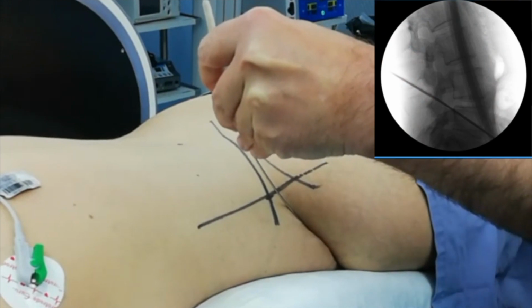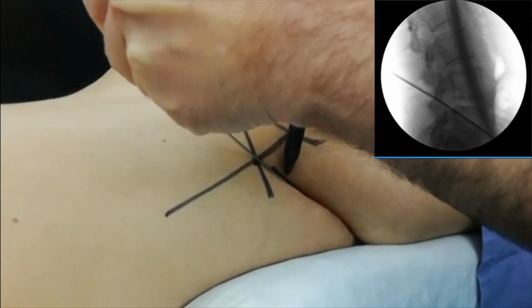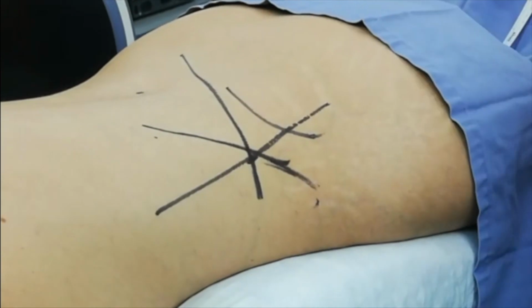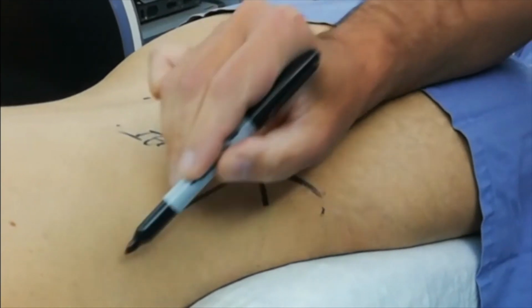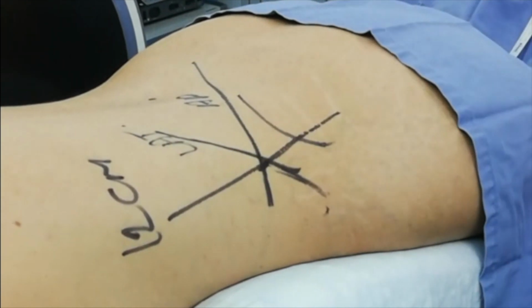X-ray please. I draw the lateral line, and then I press on the patient to keep my straight line here. And as you can see, the lateral line and the AP lines met at the 12 centimeter parallel line, and this is my entry point.